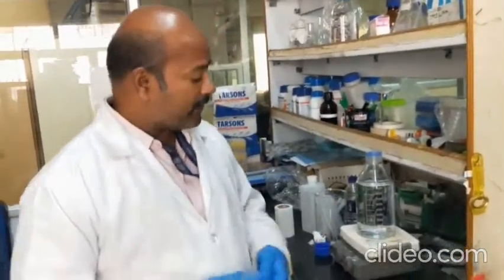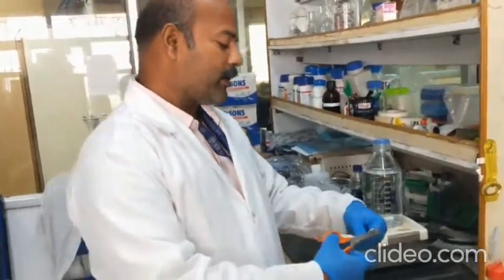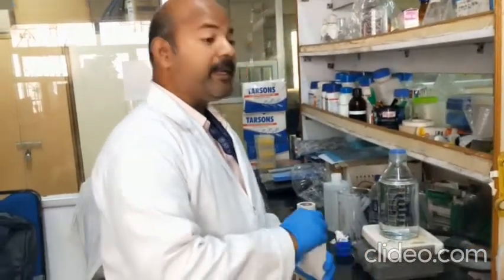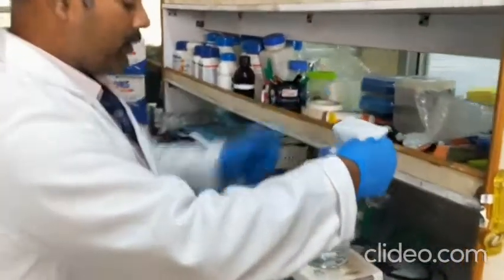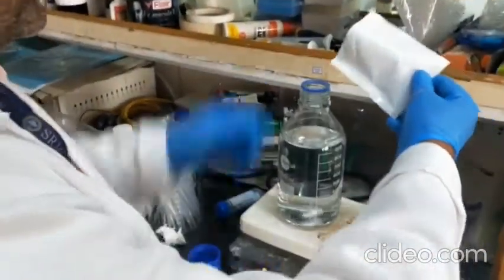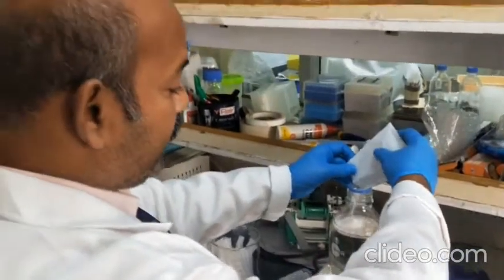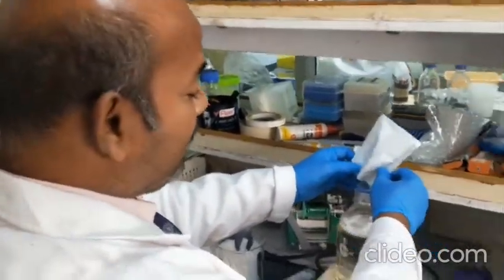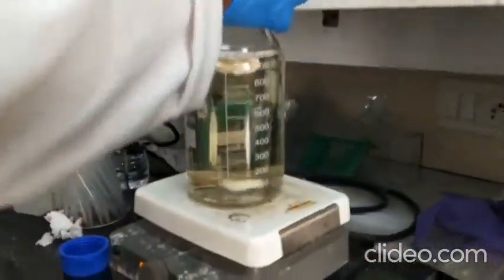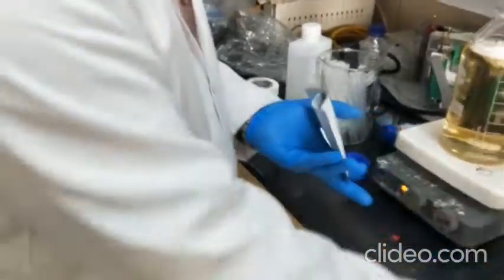Once the water is ready, you can dissolve this media — just cut open the media packet. You can pour the media powder in. It is better to have forceps. You can open it and then pour it in. Turn on the magnetic stirrer — do not turn on the heat. Pour it gently and it will start to dissolve. While dissolving, without sodium bicarbonate, it will look like a yellowish color. The media starts to form a yellowish color. Any remaining powder that stays inside the packet — wash it one more time using water.